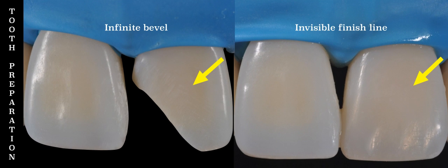Now let's evaluate the finished restoration. On the left side is the completed infinite bevel and on the right side the restored class 4. Can you see the composite tooth interface?